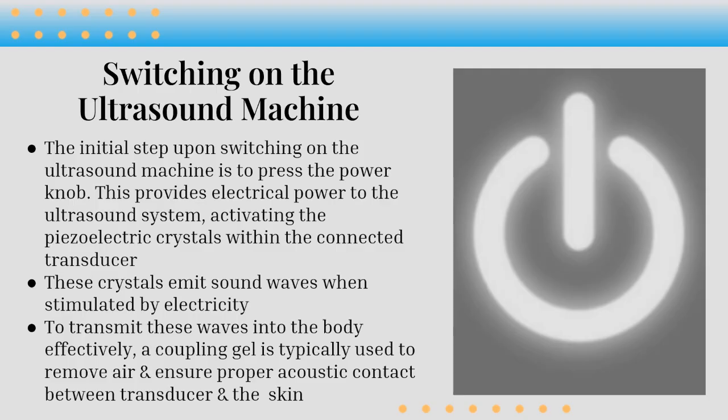To transmit these waves into the body effectively, this is the purpose of why we use gel. The gel acts as a coupling agent and typically is used to remove air and ensure proper acoustic contact between the transducer and the skin.